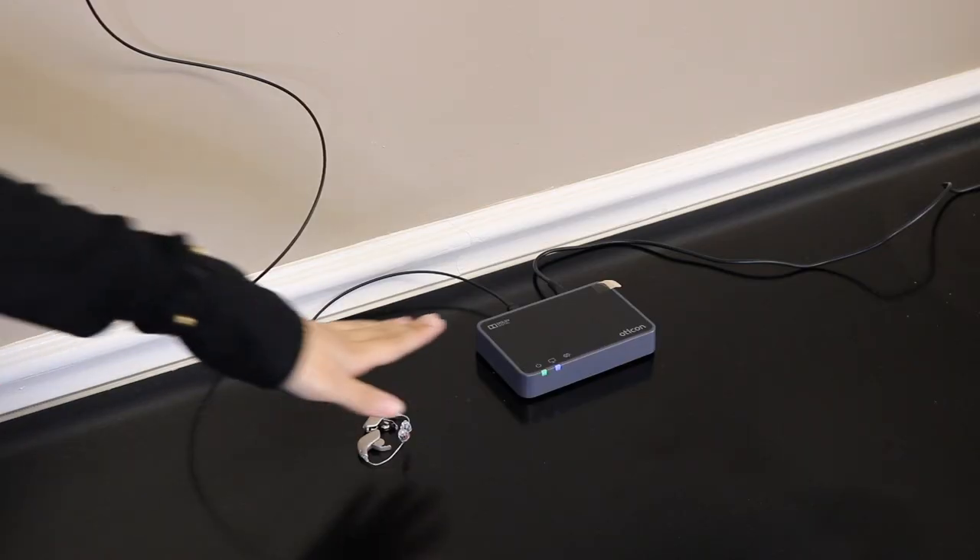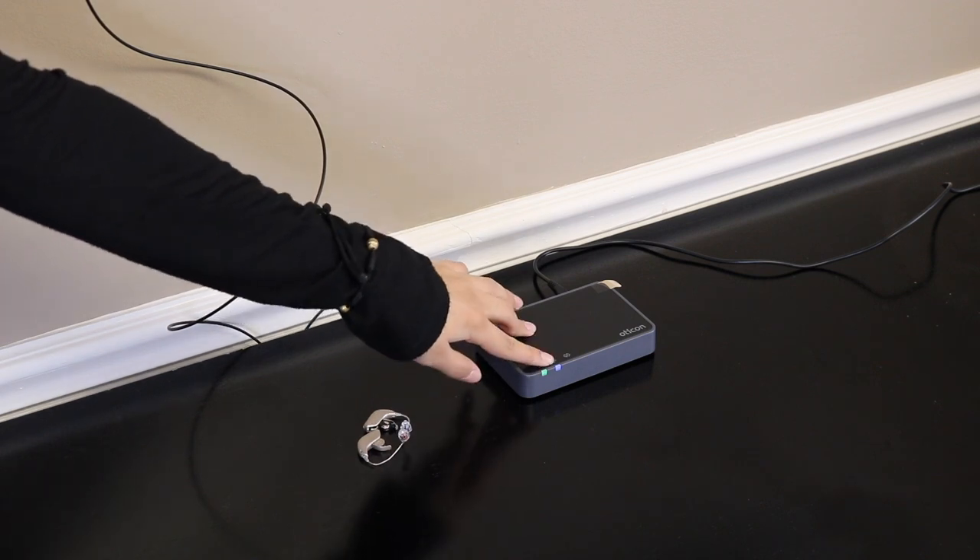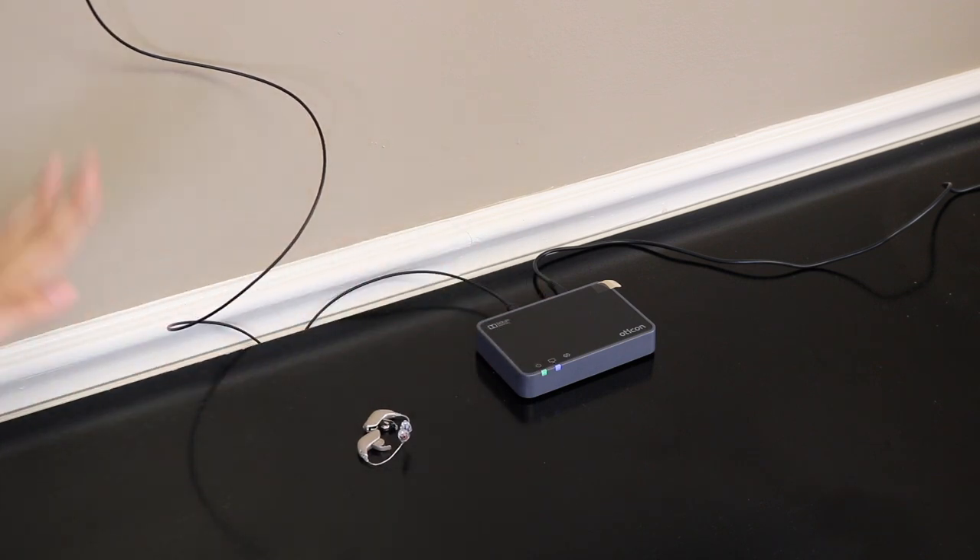As soon as you connect your TV adapter, you will see that on the power icon it is green, and then on the other side it is blue. That just means that it's not connected to anything yet and it's ready to go.